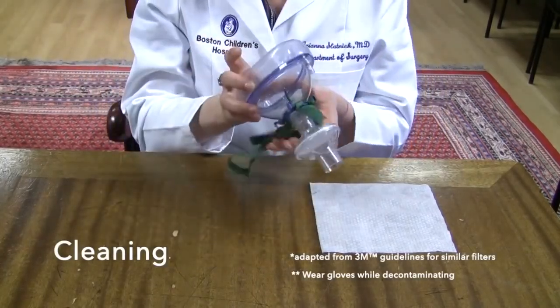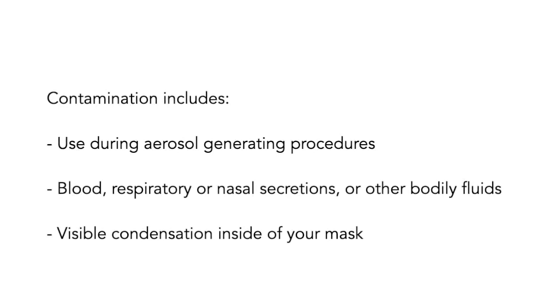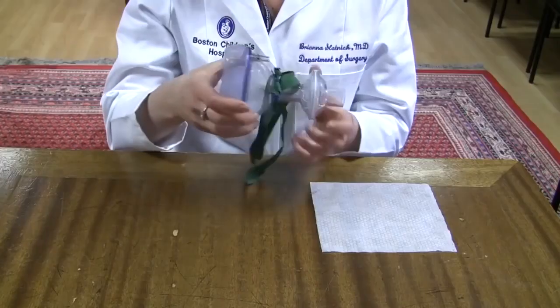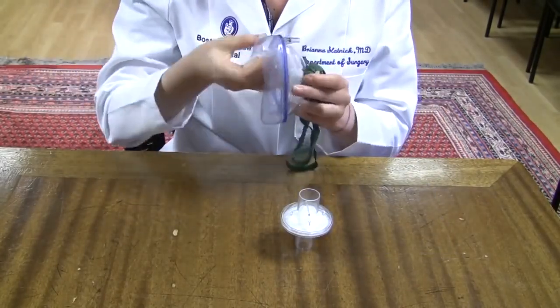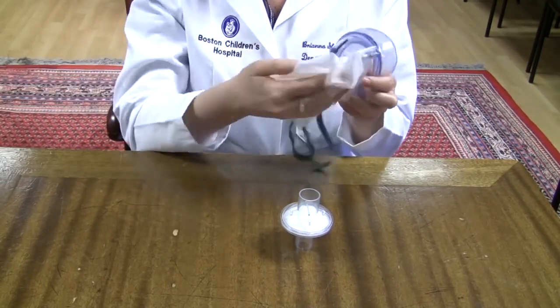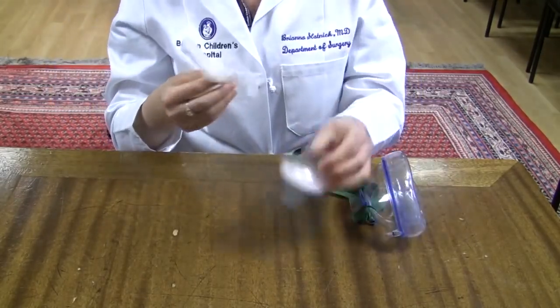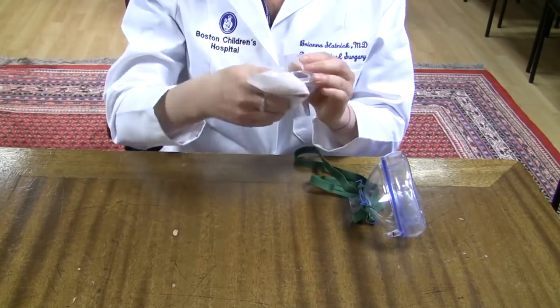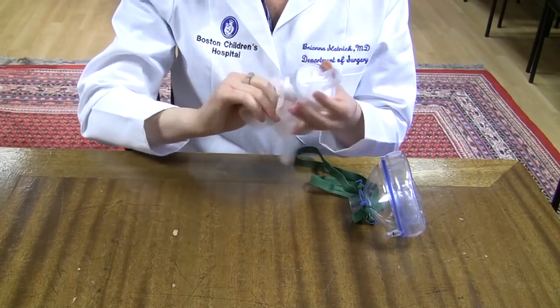Examine your mask after removing for signs of contamination. Contamination includes use during aerosol generating procedures, blood, respiratory or nasal secretions or other bodily fluids, and visible condensation inside of your mask. Disassemble the face mask portion from the filter. Wipe down all surfaces of your face mask and straps. Alternatively, you may wash in the sink with soap and water. Then wipe down the external plastic portion of the filter. Avoid getting the filter wet. Let both pieces dry completely before reusing.